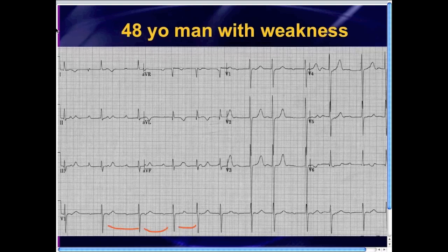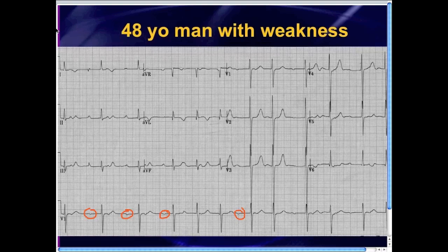The R-to-R interval is changing — it looks like it's getting shorter, and then there's another one, and then it goes back to long, and then short. The R-to-R interval is irregular. In terms of the P-waves, there's a P-wave right there, and it looks like there are P-waves there, and there, and there, but there are some other things going on. Where's the P-wave for that QRS and that QRS? Maybe there's something in there — there are little blips, and I'm not really sure what to make of those blips.